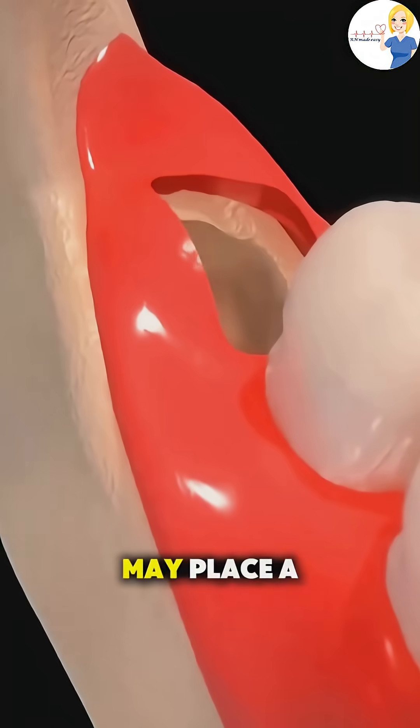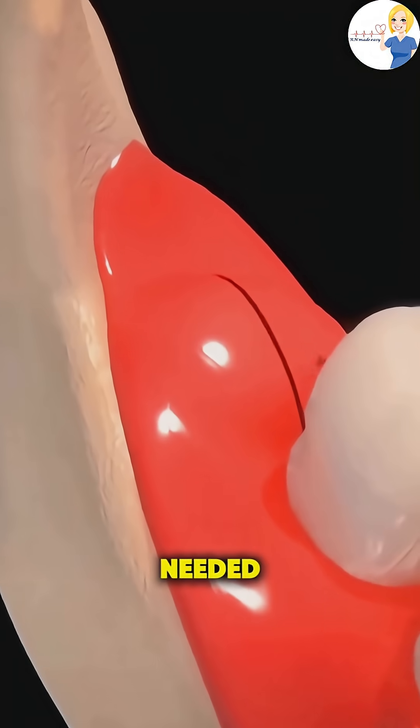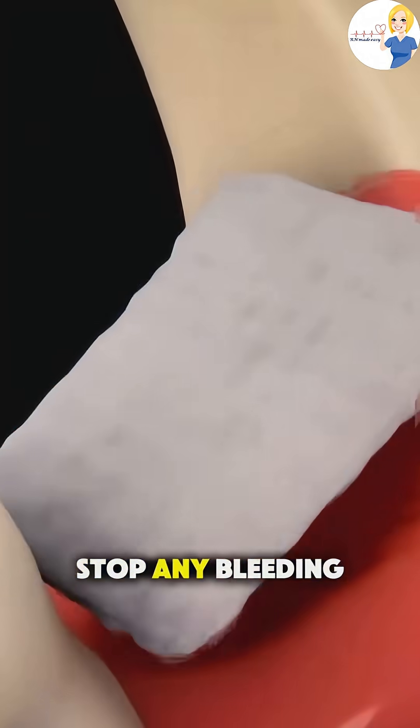After the tooth is out, the dentist cleans the area, may place a few stitches if needed, and asks you to bite down on gauze to stop any bleeding.